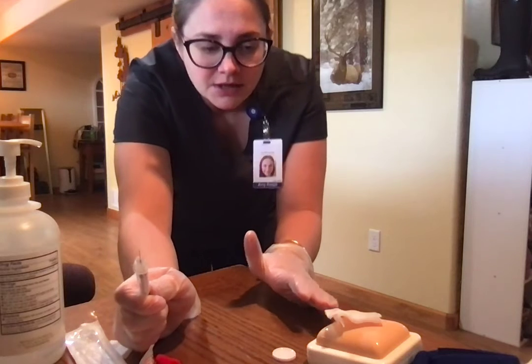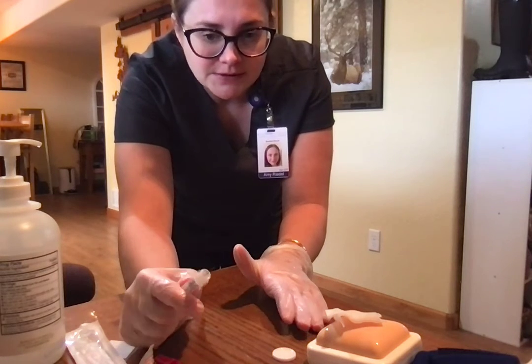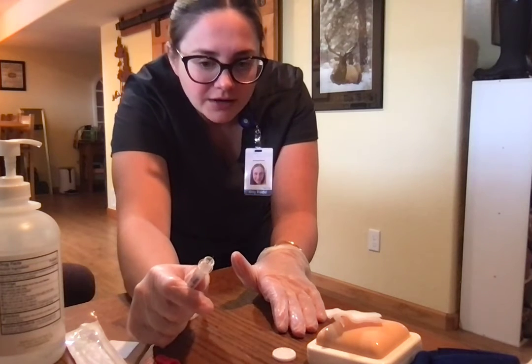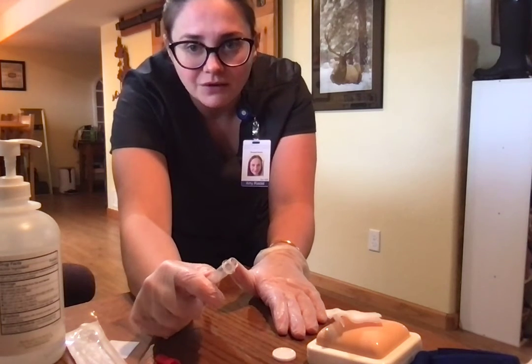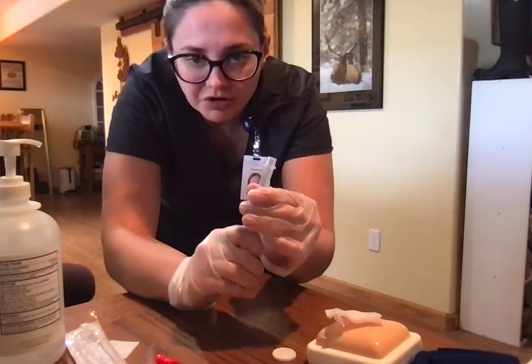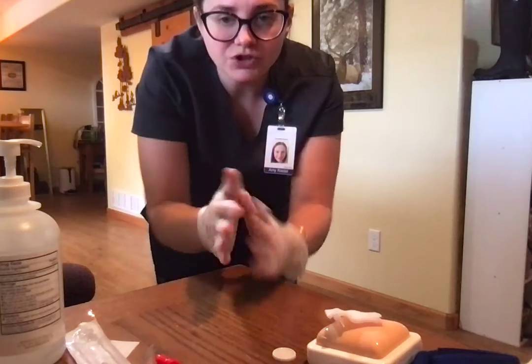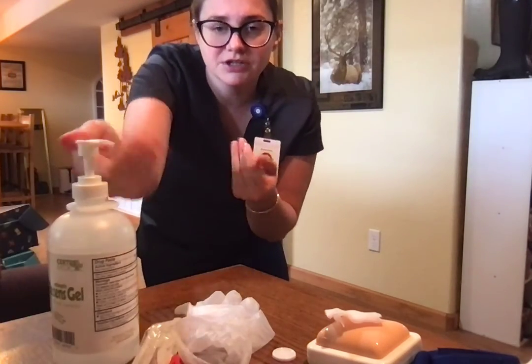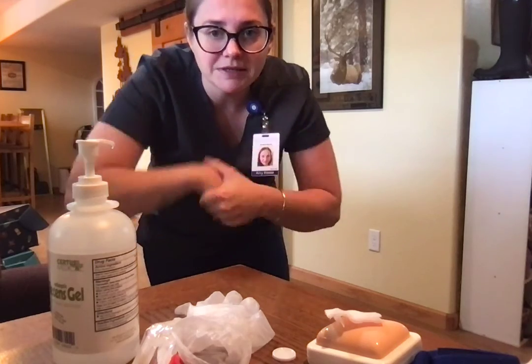or rub it, as that's going to affect the test, and then return in 48 to 72 hours to have it read, and to notify us if they're having any of those reactions. And then make sure we cap our needle, put that in the sharps container, dispose of our gloves, perform our hand hygiene again, and document what we did.